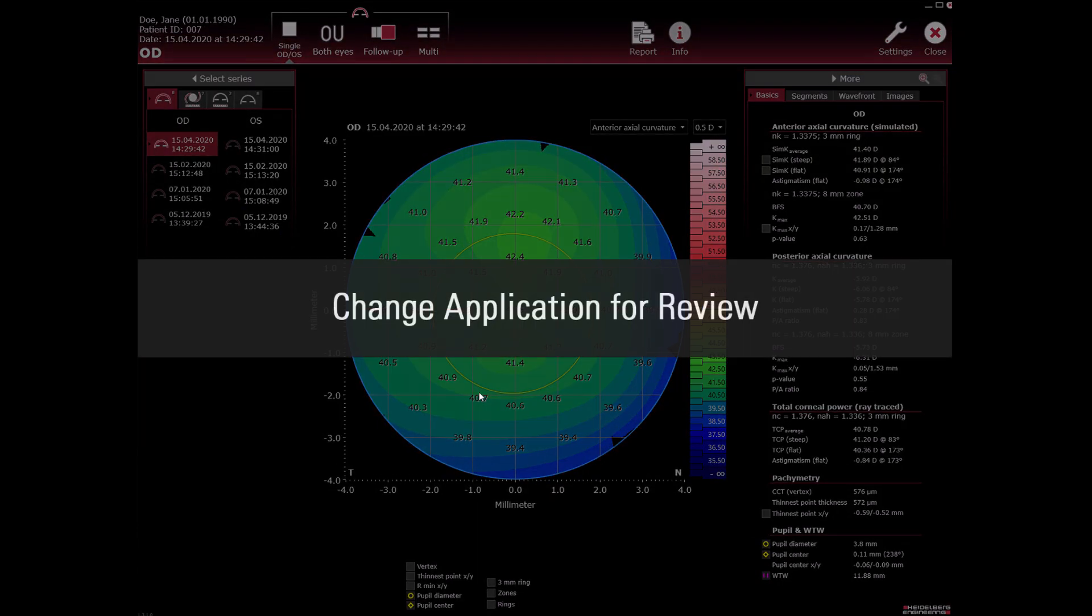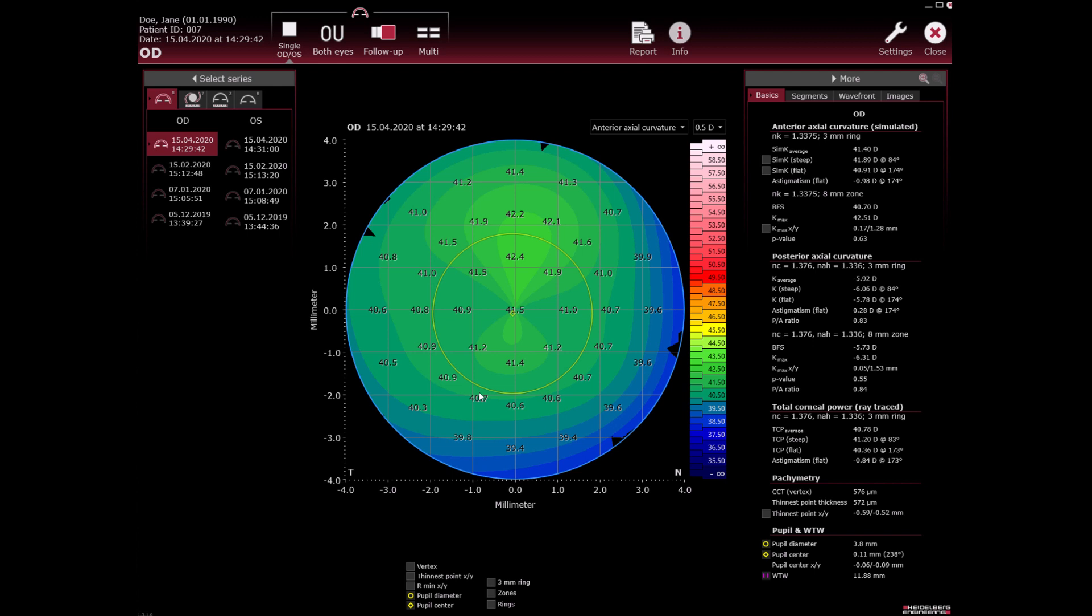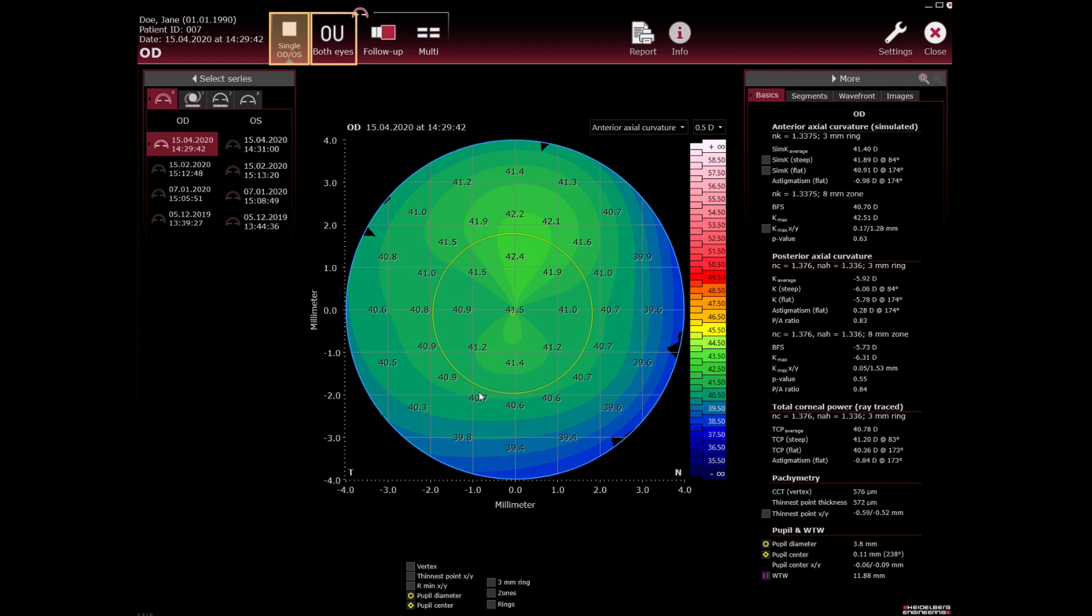Change application for review. By clicking on each symbol you can easily switch to the next application per patient to see the series. Currently cornea application with current single OD OS view. OU both eyes, follow-up and multi-view are available.